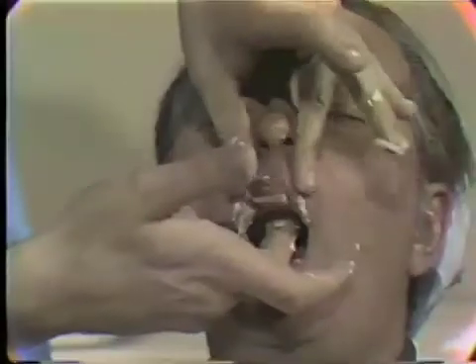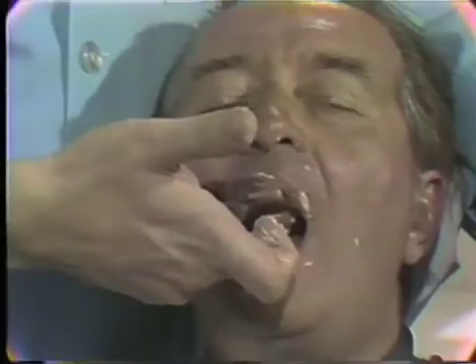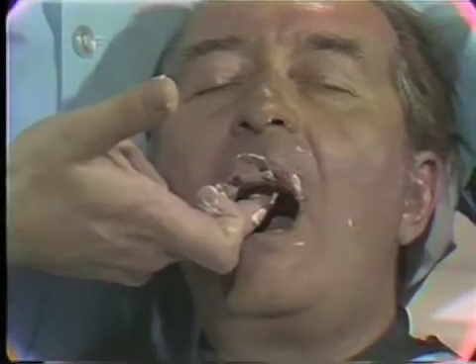A cement spatula can also be used. The tray is then inserted and seated from the back to the front, which keeps the material from running down the soft palate. The buccal and labial flanges are border molded with slight manipulations of the cheeks and lips. The patient's head is seated with the operator's arm and the tray is held by the operator until the material is set. Setting time is lessened when warmer water is used.